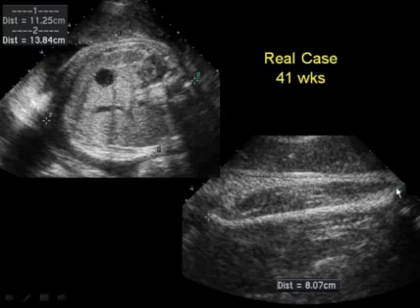And this is the distal end, and here's the distal femoral point heading down. And a better spot to put, or more accurate spot to put the cursor would be right here. And this end, again, you don't have the sharp end, and it's difficult to know where exactly on this curve is the correct spot for the femur.